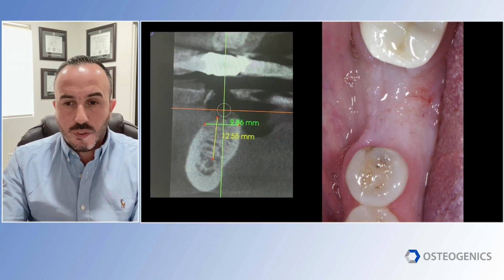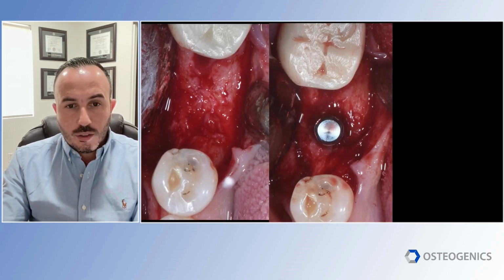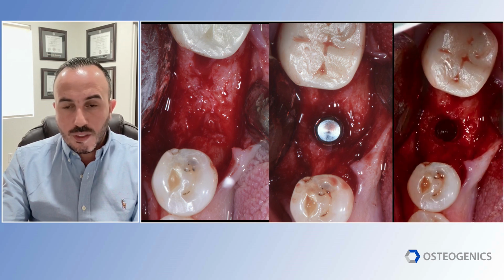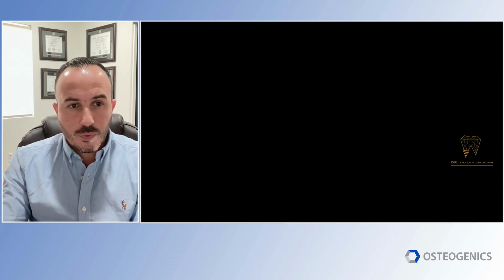So the patient comes back. We've regenerated well in width and height. We have nice soft tissue. We have good bone by 4 months. We place the implant where it needs to be, single stage, and we send the patient back to the restorative dentist.